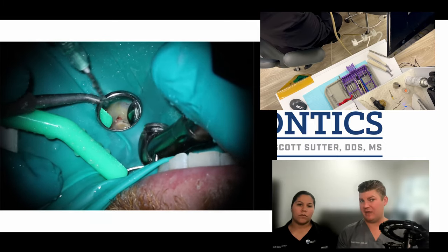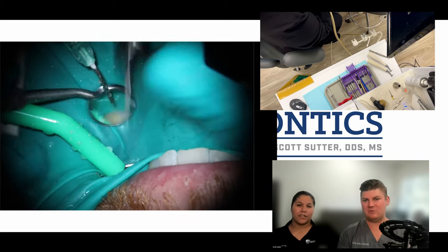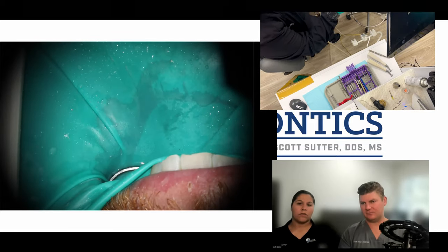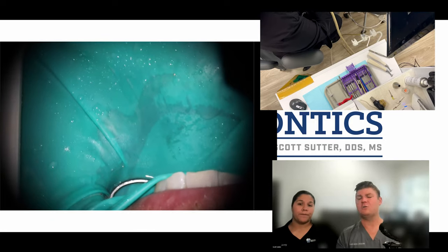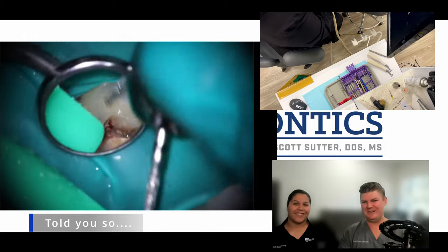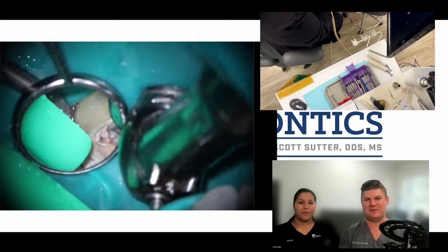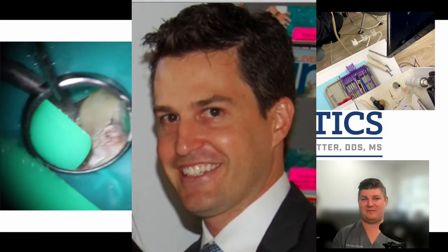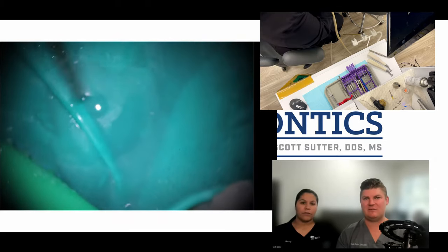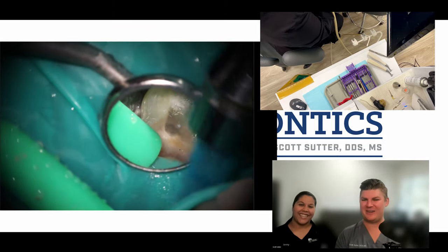The other thing you'll notice is I'm not spending much time switching out burrs because I have three high speeds. I can look at the case beforehand and know I'll need the flat disc to flatten off the tooth, the carbide to get rid of the caries, and then the workhorse burr to get down inside and do the preparation for the access. That workhorse burr is actually named for Dave Prusikowski, a fantastic endodontist out of Florida who was one of the first to find its use — a bunch of us just call it that. Shout out to Dave.